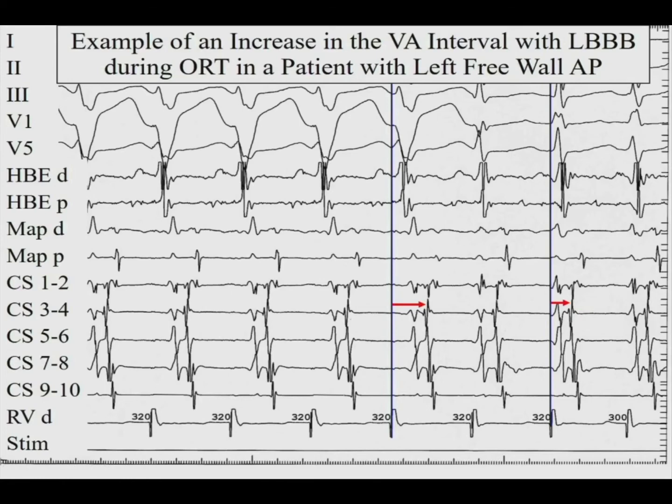All right, so that's step one. Step two is to realize all the other things that can throw you off. One, the tachycardia cycle length doesn't change. And it doesn't change because when there's a left bundle block and it takes a while to get to the pathway, the AH is short. It's hard to see, but that's the A, that's the His. And then when the left bundle resolves, the AH gets longer. Here's the A and the His. And the tachycardia cycle length, at least at the beginning, is the same.